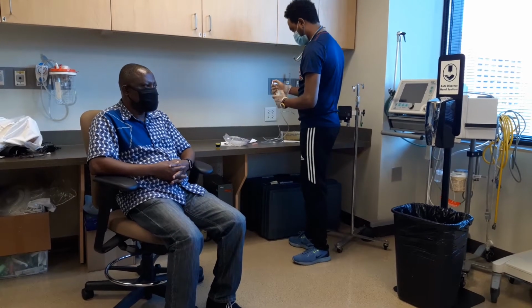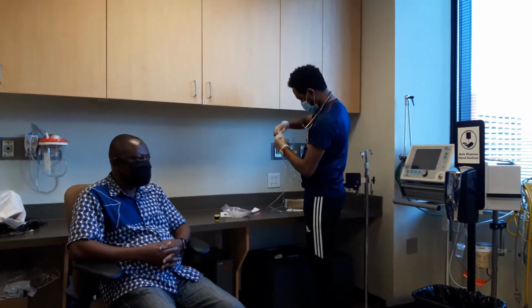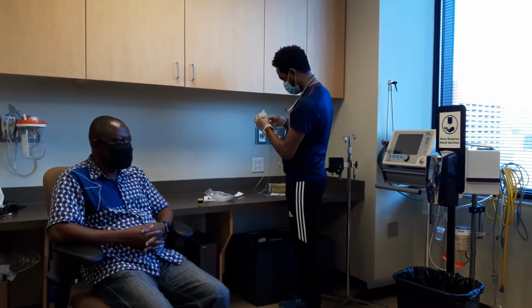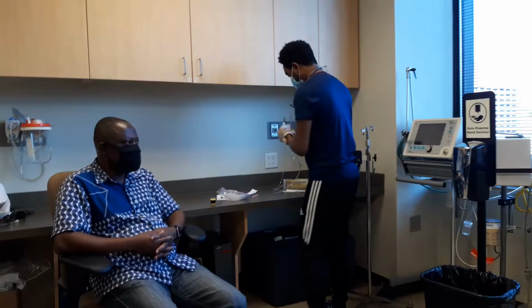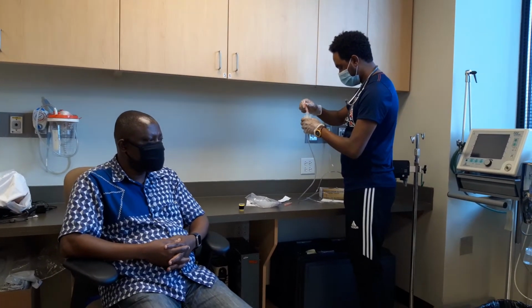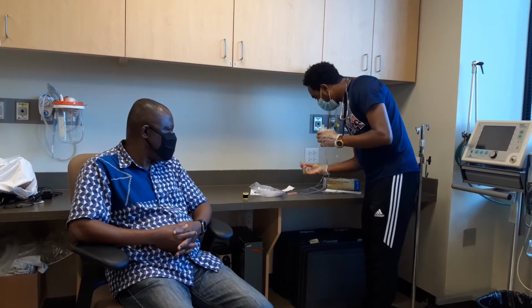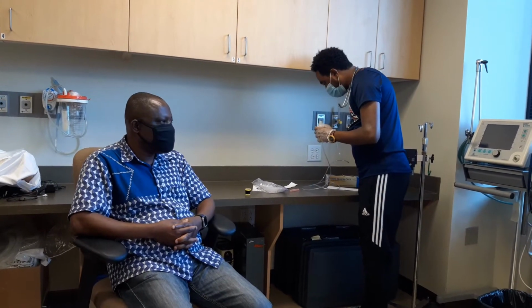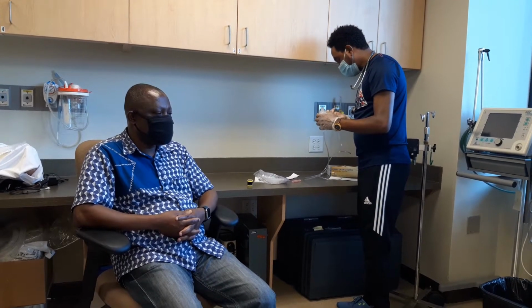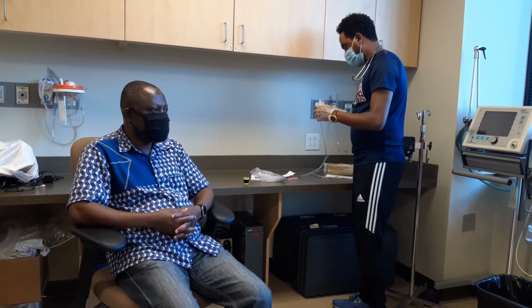I'm going to put first 2.5 milligrams of albuterol, and then 500 micrograms of Atrovent.